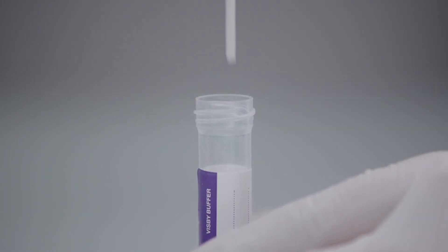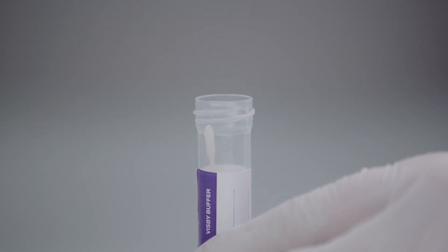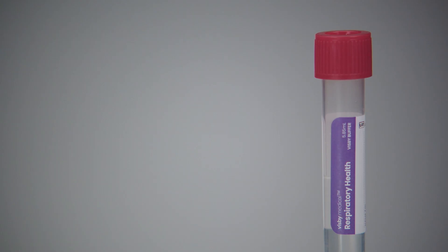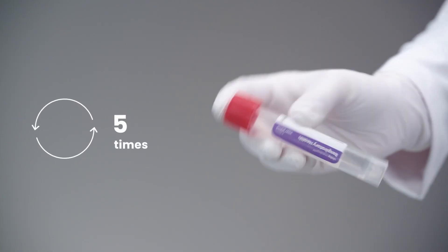Place the swab into the buffer tube and break the handle at the break point before replacing the cap. The sample is stable in the respiratory health buffer up to two hours at room temperature or up to 48 hours if refrigerated. Gently invert the patient sample five times to mix.